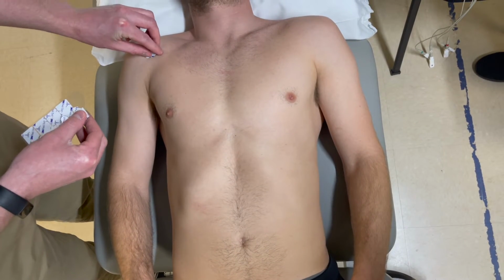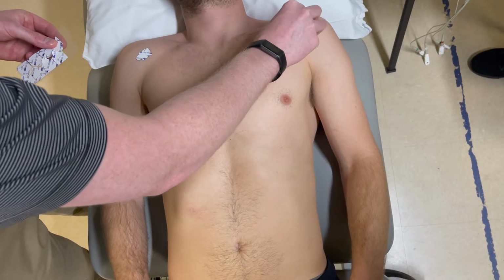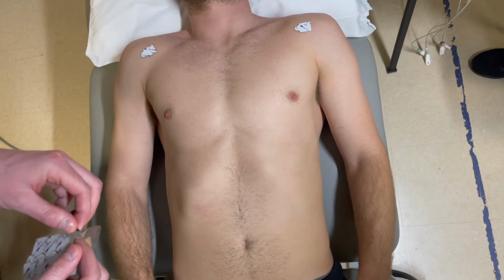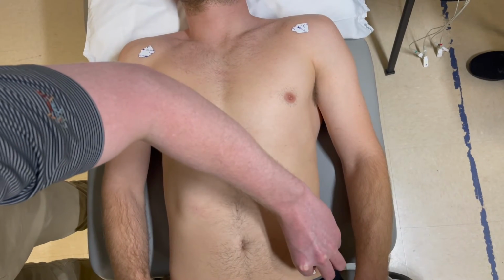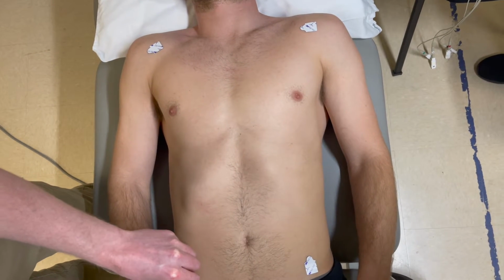The arm electrodes can be placed anywhere between the upper chest quadrant and the elbow. In this video, we will be placing it on the shoulders. The leg electrodes can be placed anywhere between the ankle and the torso. For this video, we will be placing them just above the ASIS.